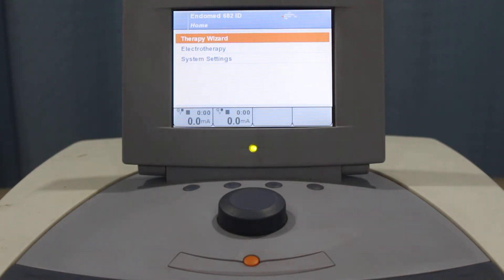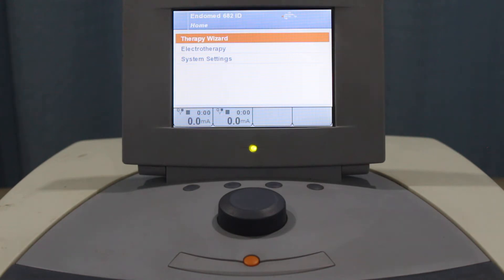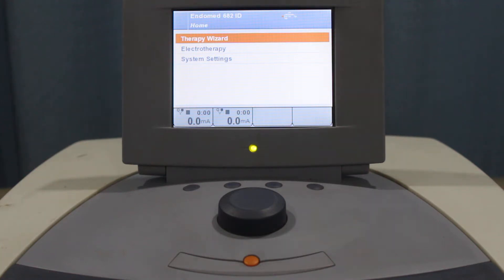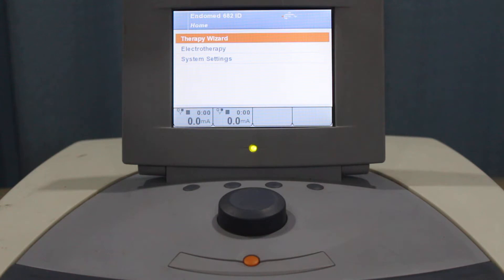Bismillahirrahmanirrahim, assalamu alaikum. Today we'll be talking about how to use the Enraf-Nonius 682 ID unit. It's a multi-stimulator and we'll be discussing how to use this unit effectively. This is a brief orientation of this unit.